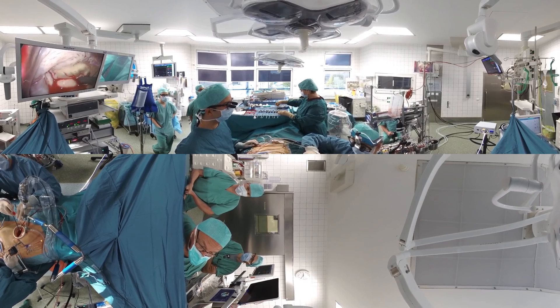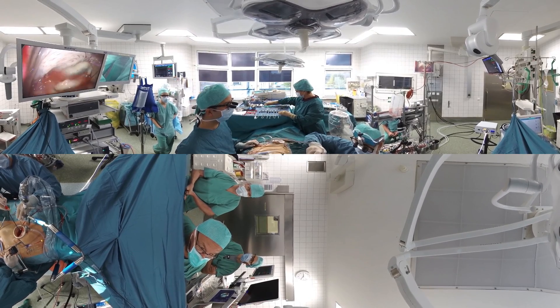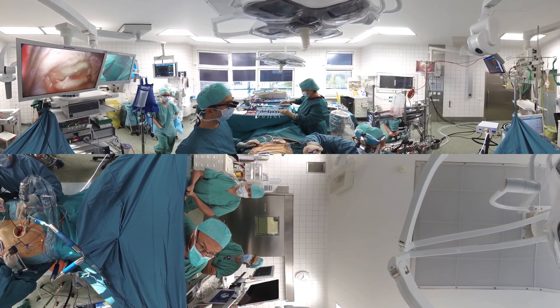Careful inspection of the mitral valve, which is formed of two leaflets, is performed with a small hook.